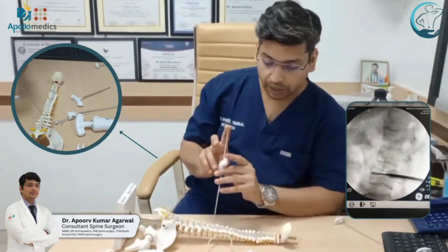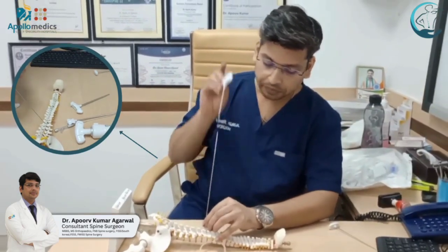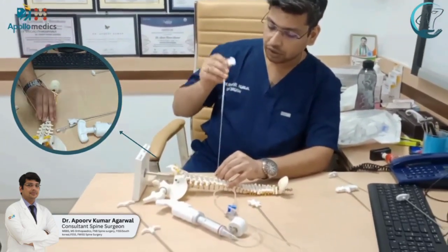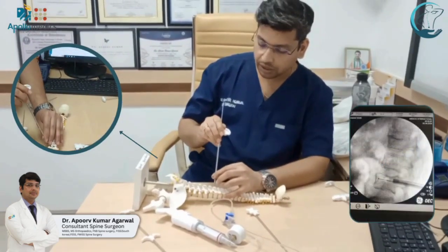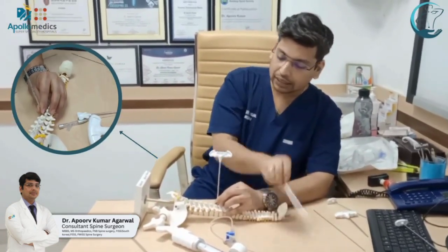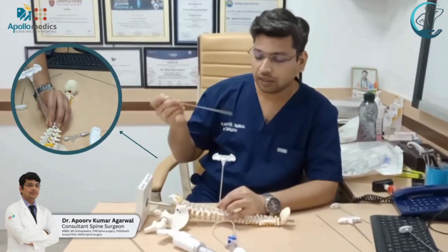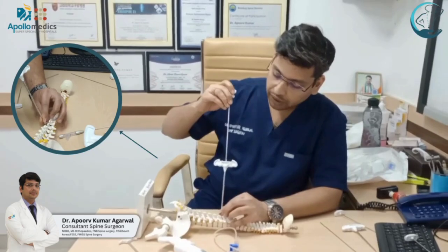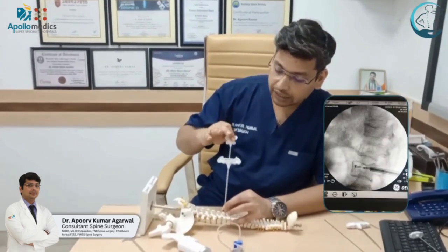Once the guide wire is in, we take out our Jamshidi needle and replace it with a working cannula. This working cannula goes in and we then remove the guide wire. After that — and this is done bilaterally — we use a drill, going into the vertebral body through the working cannula.